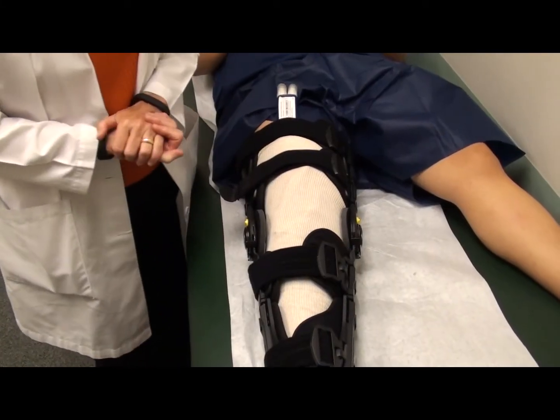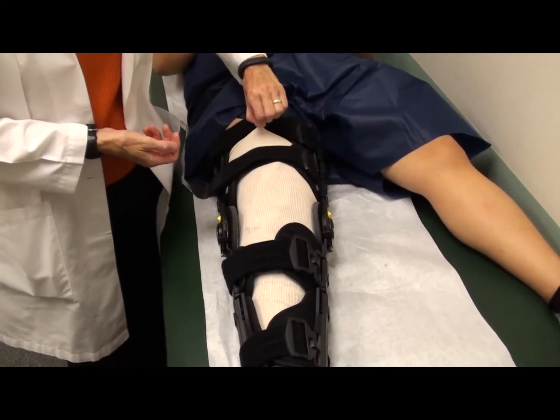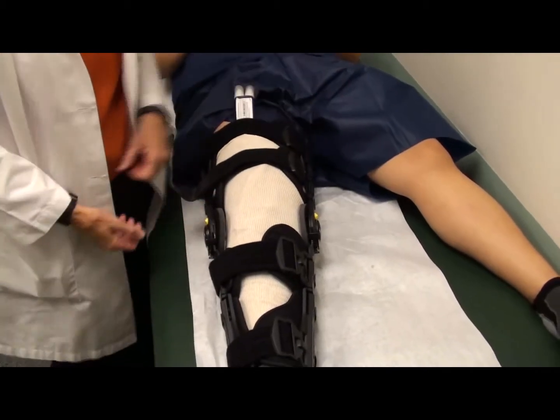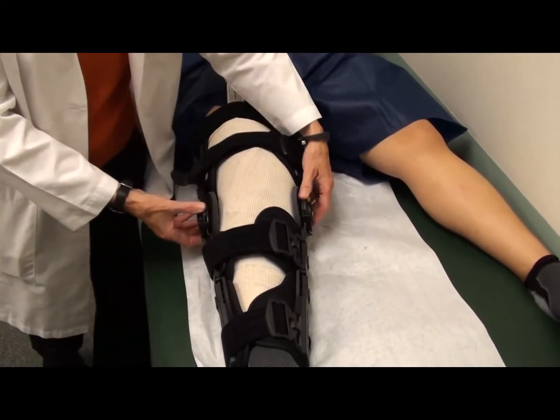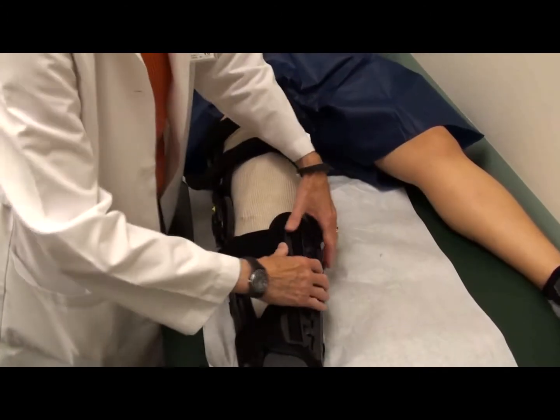So this is probably something like what your dressing looks like. On our model here we have a different kind of stocking, but most have a white stocking on the leg which covers everything and just keeps everything contained. The brace has hinges at the center which should be locked to keep your leg straight.